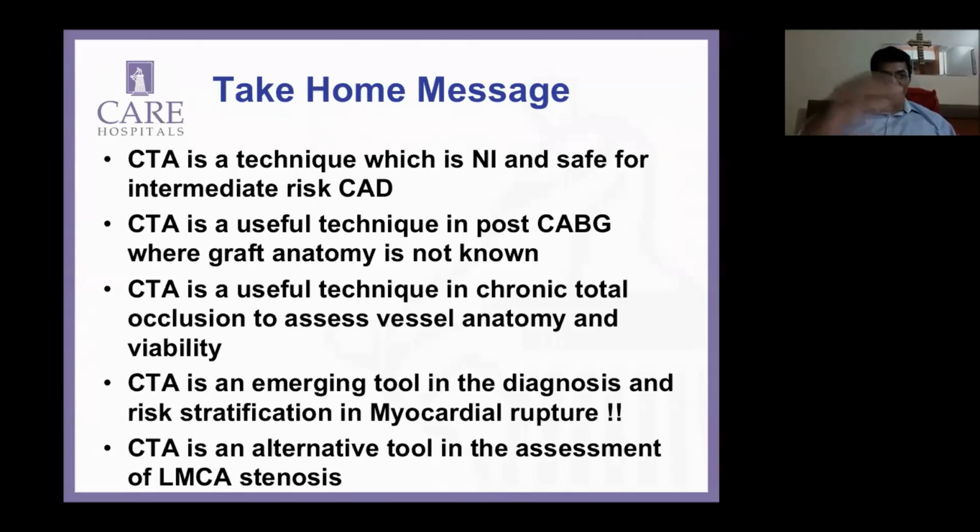So I'll quickly complete by running through some good take-home messages. CTA is a technique which is non-invasive, and it's safe for intermediate risk CAD at the moment. That's the label indication. It's a very useful technique in post-bypass patients where graft anatomy is not clear or not known very well.